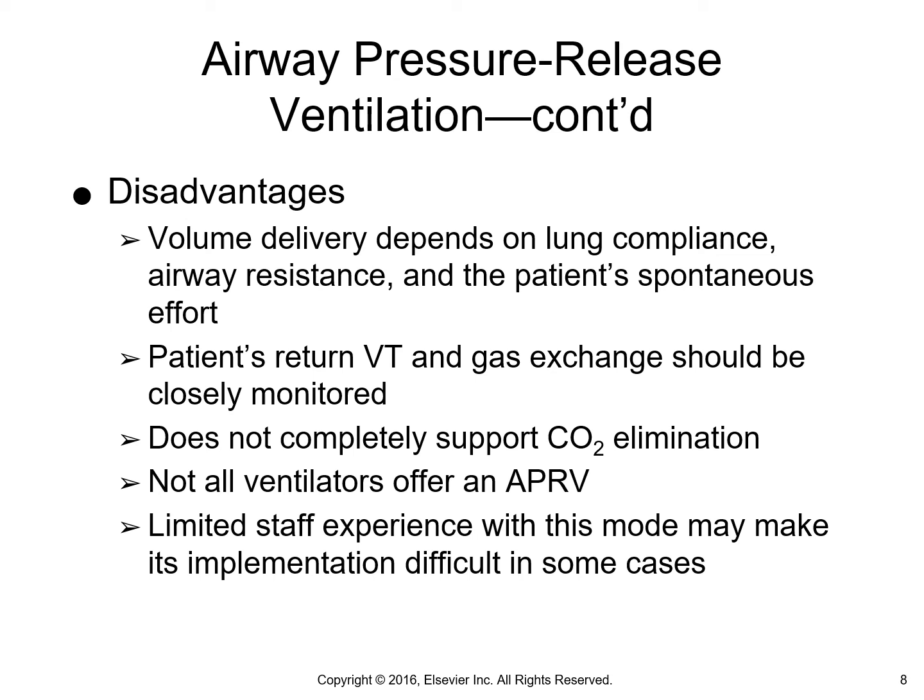However, it does have its disadvantages. Because it is basically pressure targeted, the volume delivery is then dependent on lung compliance, airway resistance, and spontaneous effort. Also keeping in mind that it does not completely support CO2 elimination. So with COPD patients, it might not allow sufficient expiratory time. Not all ventilators offer APRV, and of course there is some limited experience with staff, so it's kind of up to us to promote it when we see that there's good indication for it.